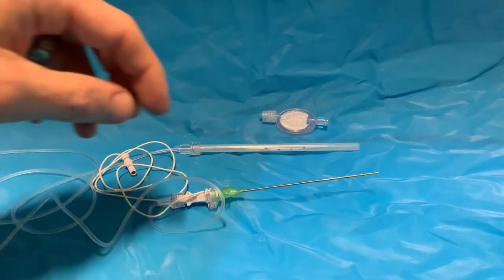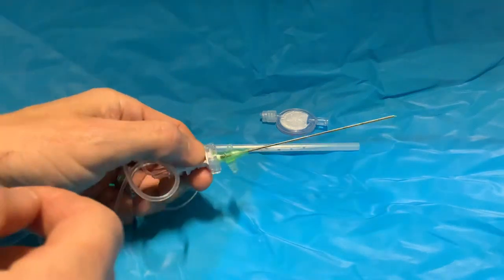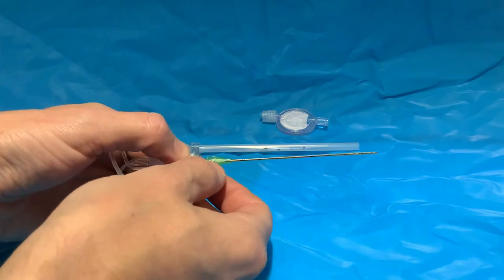When you open the ECATH, you'll have a cannula loaded onto the needle already.